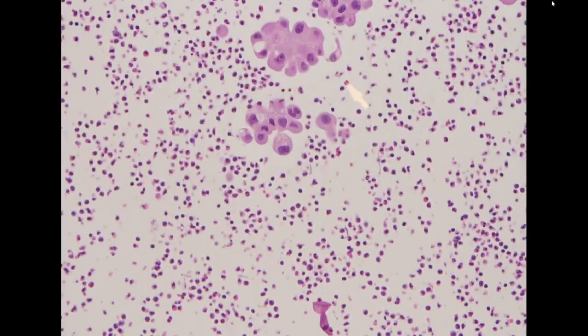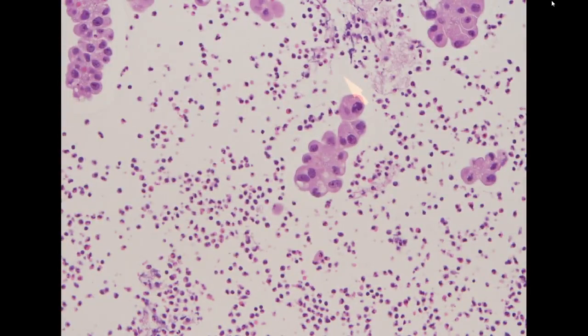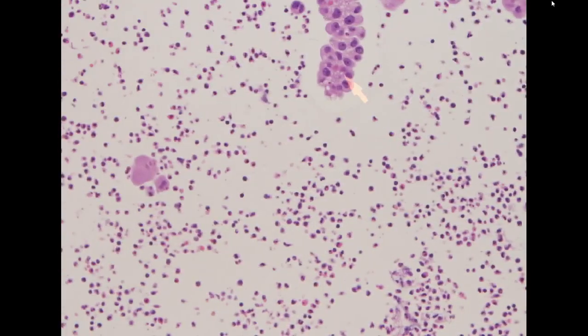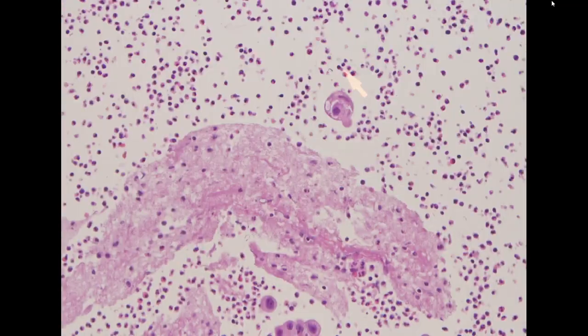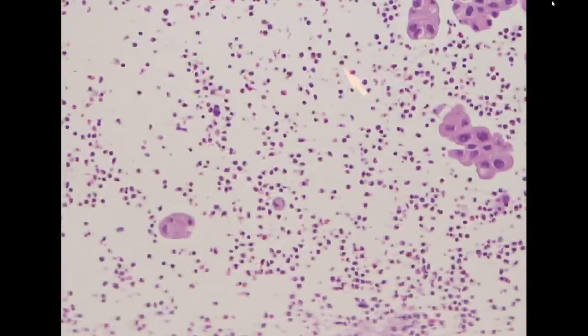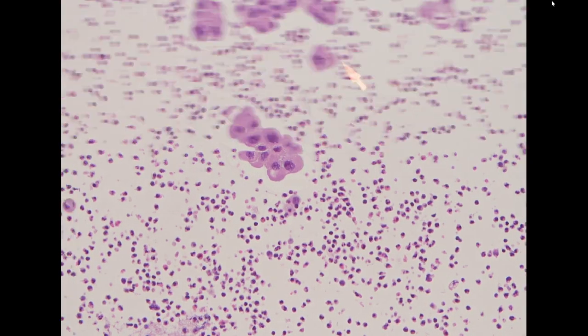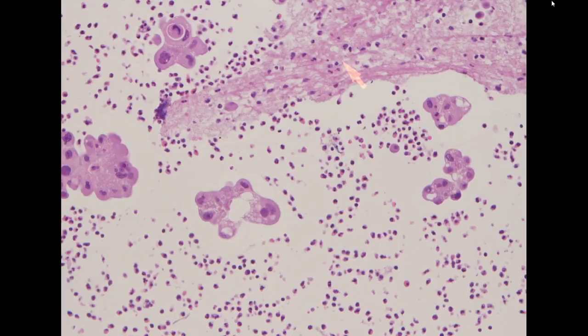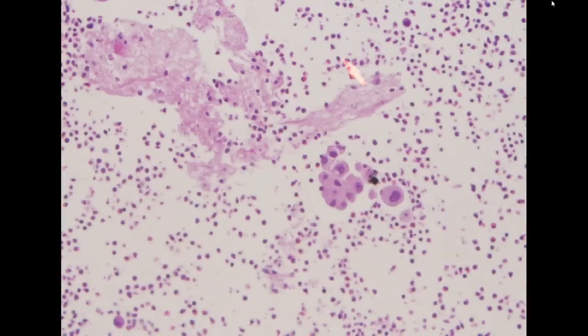With this specimen, we can perform TTF1 for confirmation if this is a new patient. We can also perform molecular testing on this type of specimen for either driver mutations or drug-resistant mutations such as EGFR T790M. This cell block preparation is suitable for molecular testing because we see a lot of cancer cells over here.